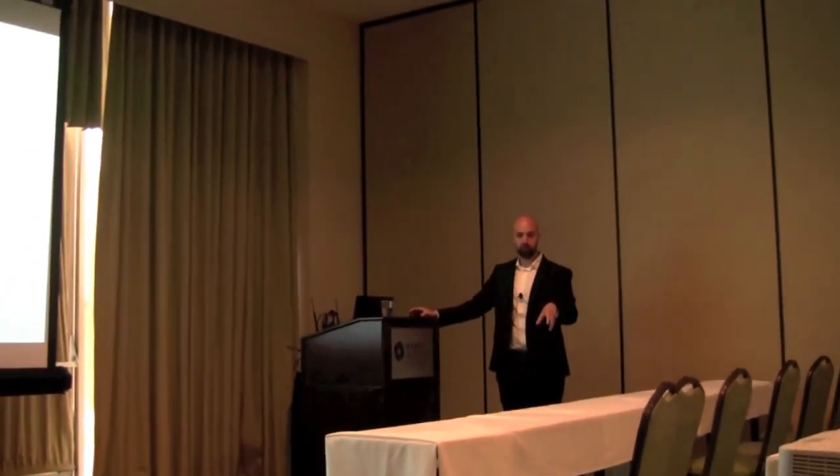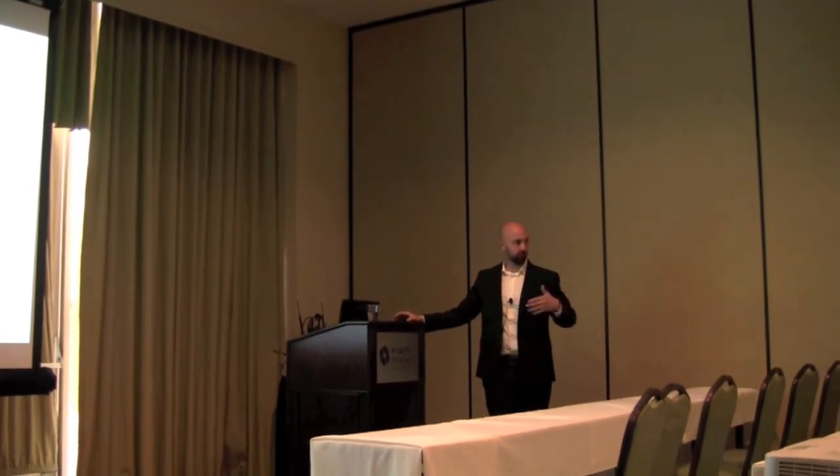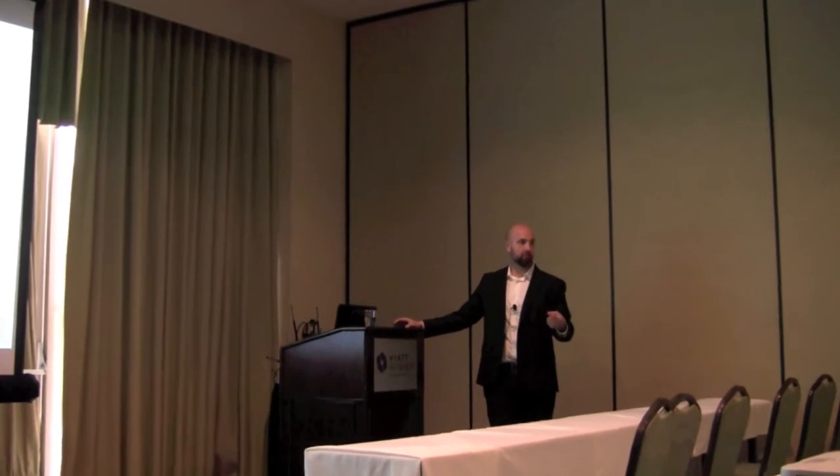Have a master model that you design. Go ahead and send that out. Have them print it, and when it comes in, do this comparison process so that you can actually see how accurate the models are.